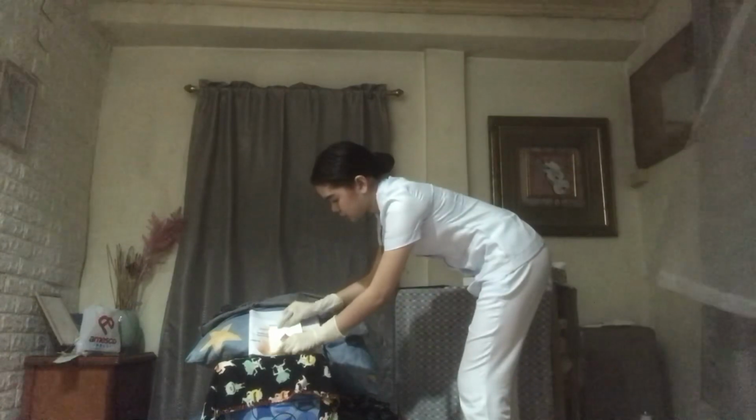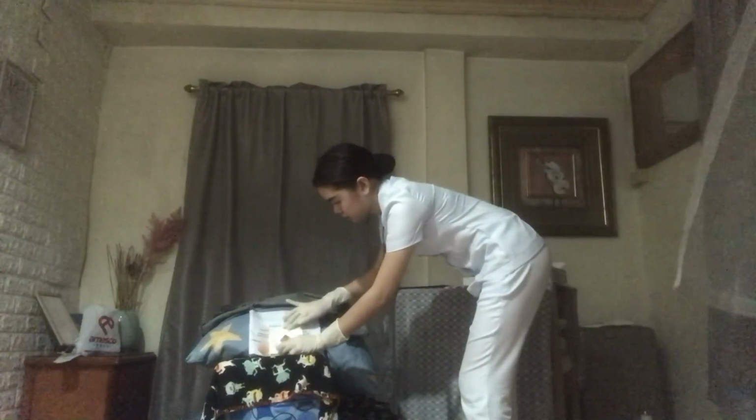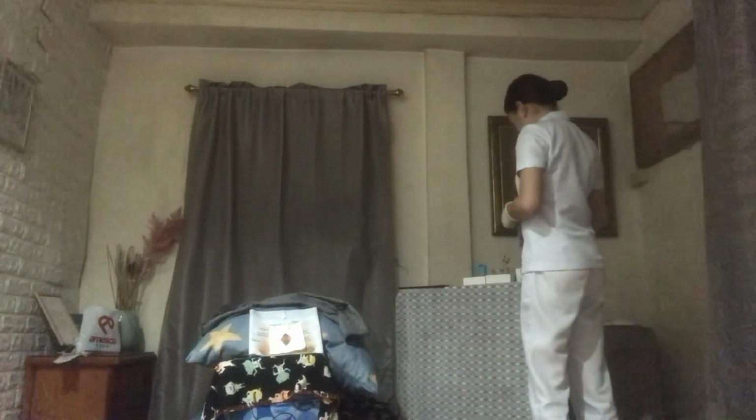So now I'm done donning my sterile gloves. Now after that, put the eye sheet. So after that is to lubricate the catheter for about 1.5 inches, being careful not to plug the eye of the catheter. So I will lubricate.